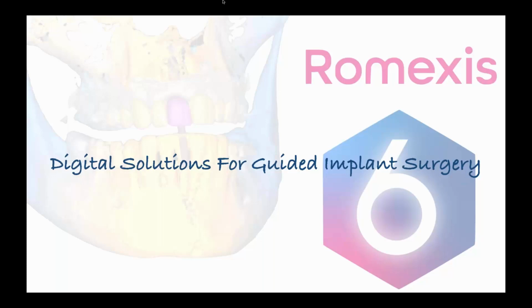And the focal point for that is definitely the software that allows this to happen. Again, we're really fortunate to have had the ability to use Romexis. We have a lot, if not all, of the major software systems available to us at MUSC for guided implant planning. And a lot of them have their strengths and weaknesses.